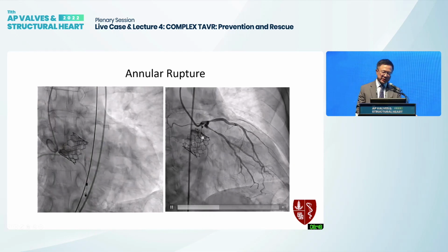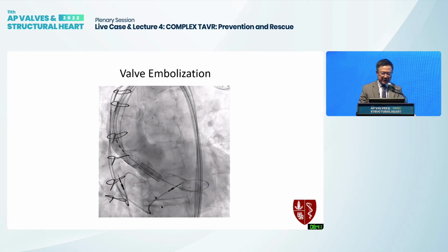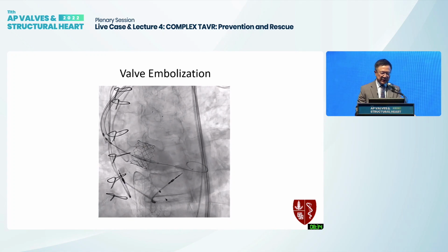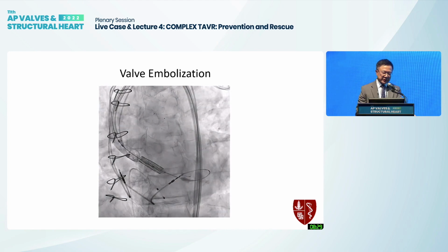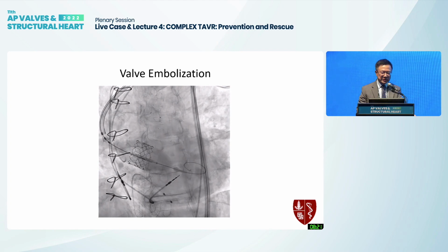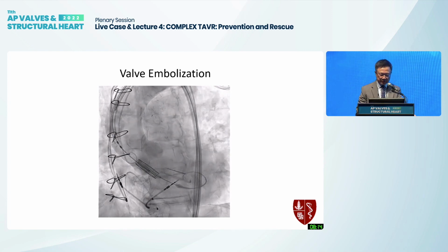And obviously from the top here, you can see there's some staining. So there's a supra-annular rupture here. Also, these one-and-done procedures look pretty simple. You can see the valve pops up if you're not careful pushing the valve down. At this point, you hope for the best, but when you see the valve turning, you know that the valve is now actually loose. You have to figure out whether you need to valve-in-valve, or how you prevent this valve from migrating south. Going north is not so difficult, because going south will be a problem into the ventricle, for example.